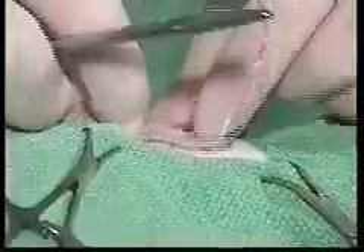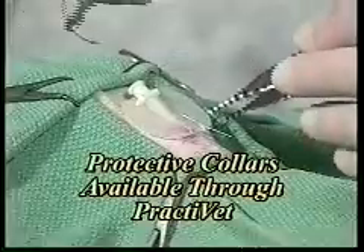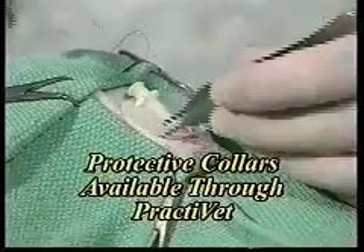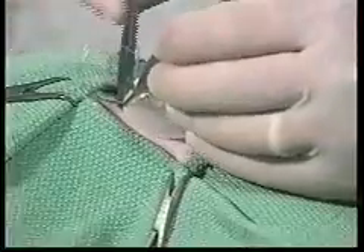This skirt is quite tough — it has a Dacron material built into the silicone. However, if a cat is very aggressive, they can still tear the silicone and shorten the life of the tube. So what we will frequently do is make a little sock that goes over this and protects the whole apparatus, at least until the cat gets used to it — and it helps clients too, as they would rather not look at it. Now we are just going to fill in the rest of the stitches about every 10 minutes around the clock. We want to be sure not to tie the stitches tight; we just want to lay the skirt down against the skin without cutting through.